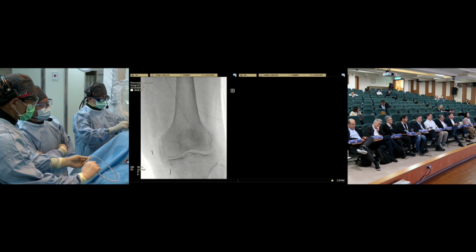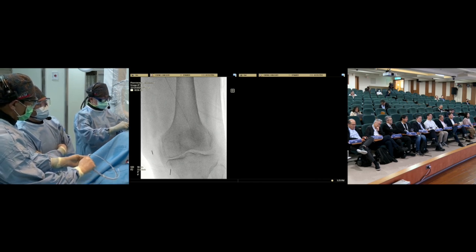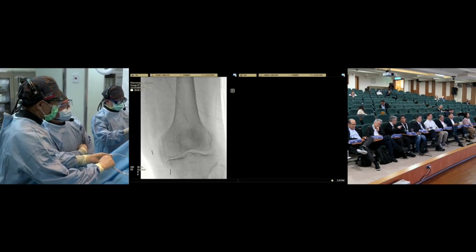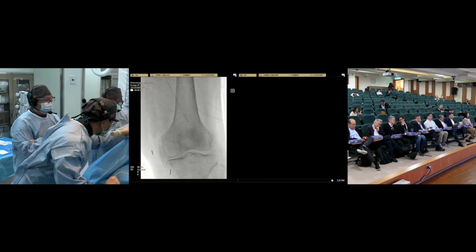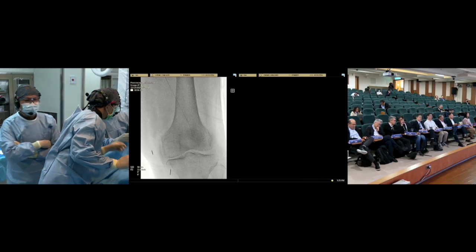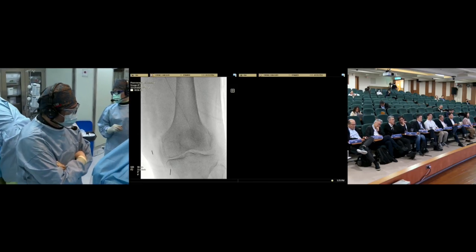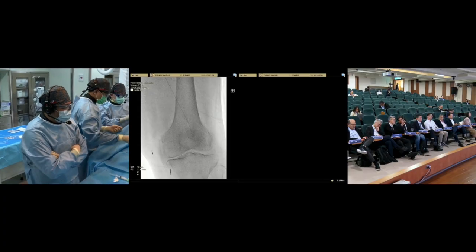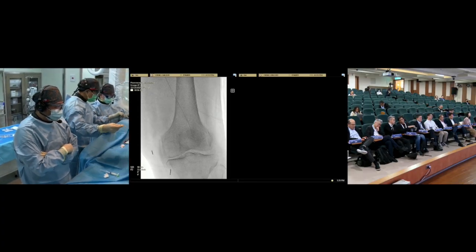But if you use a permanent embolic agent, you should pay attention to adverse effects after embolization. The post-embolization ischemic pain will be more prominent, and sometimes you will see skin ulcer. You should use ice packing or painkillers to relieve the post-embolization ischemic pain.